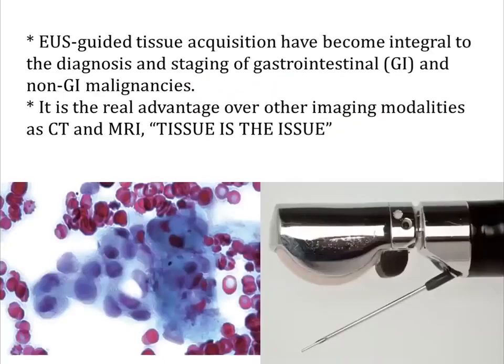Actually, EUS-guided tissue acquisition has become integral to the diagnosis and staging of gastrointestinal and non-gastrointestinal malignancy, and it is the real advantage over other imaging modalities such as CT and MRI, because in most instances, tissue is the issue.